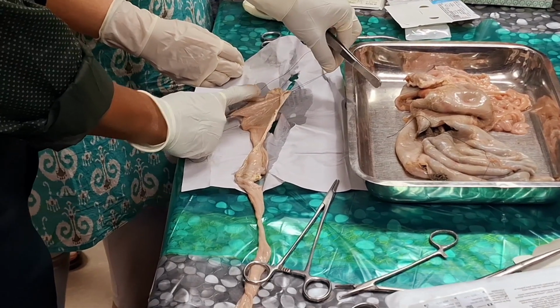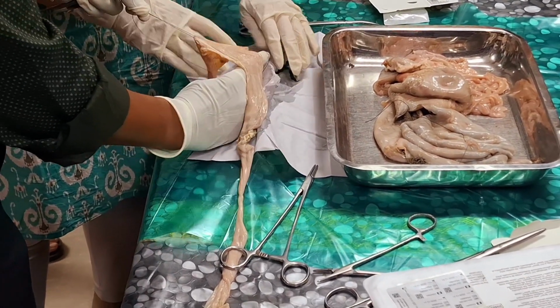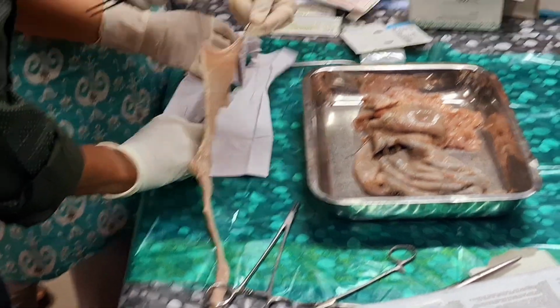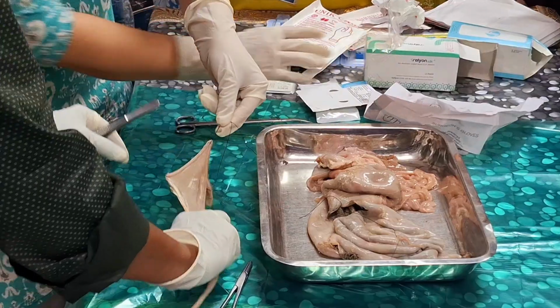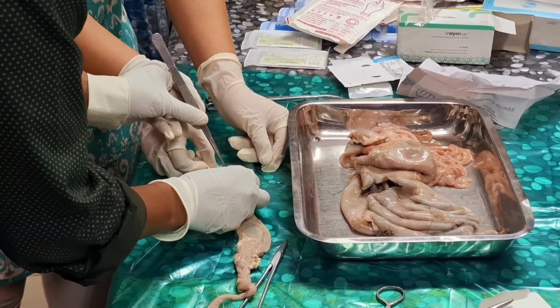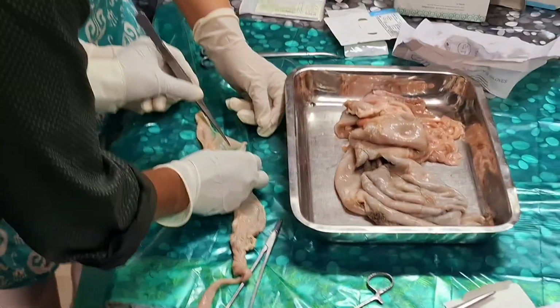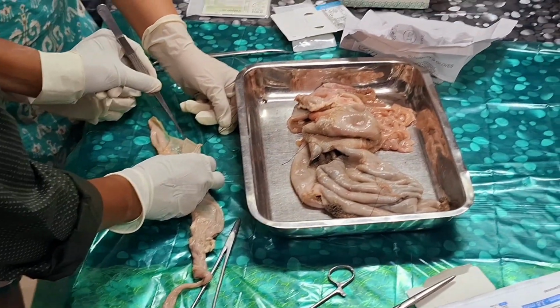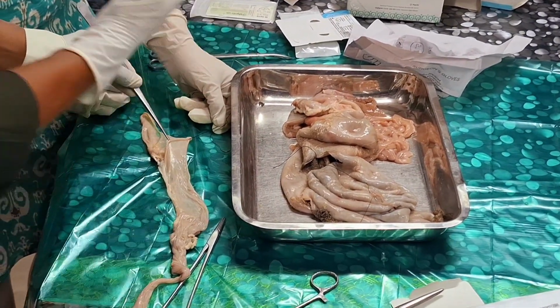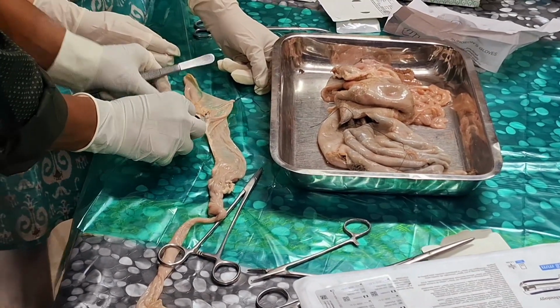After completing this anastomosis, you can do the anterior anastomosis. So this will be your fourth layer, the posterior layer, and after that you will do a full thickness layer. That is the third layer. This one is the second layer. And you will take Lembert stitches in the anterior position. That is the first layer. So you can start with Lembert stitches.